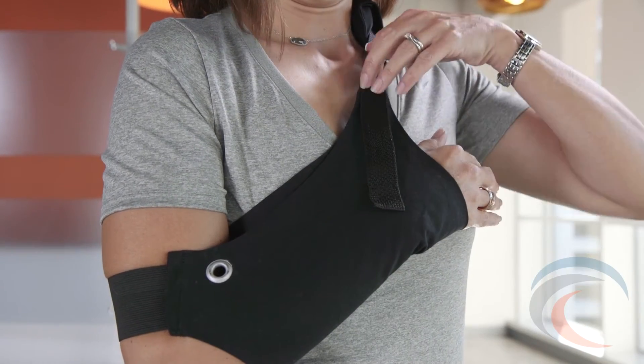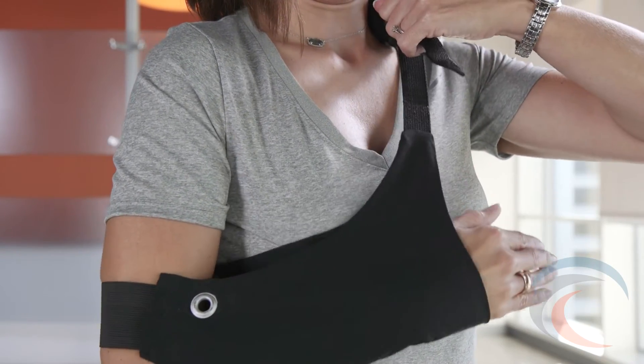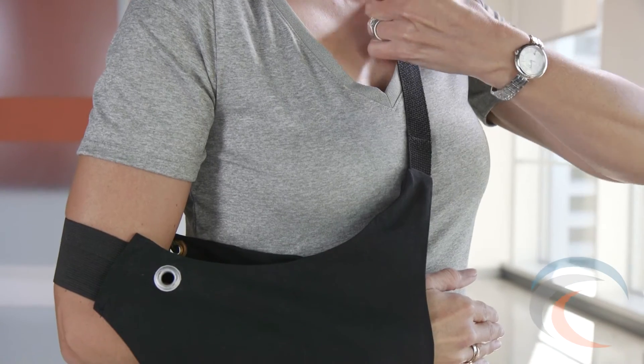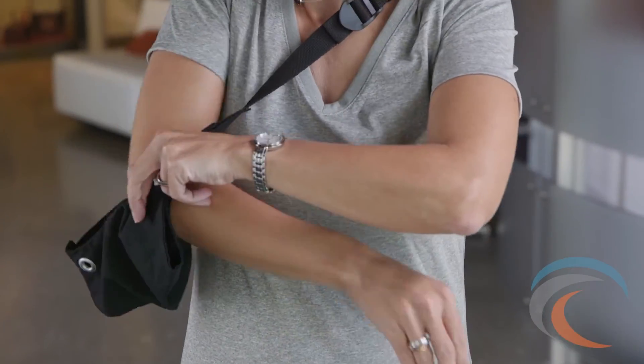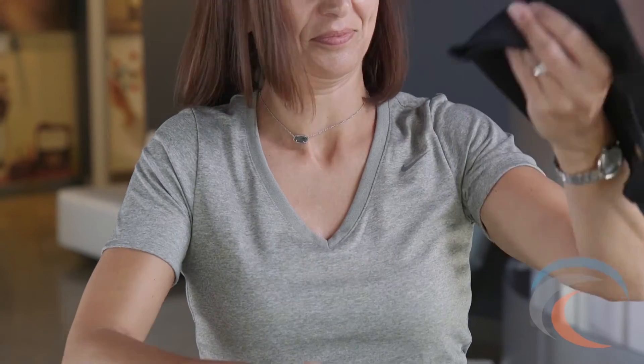The product returns to the traditional sling position by simply lifting the pulley buckle to release the pulley strap. Easily remove the Wingsling by sliding the arm forward and removing the elbow from the elbow pocket.